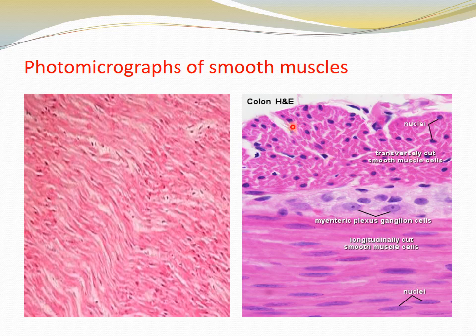So these are the transversely cut bundles or the fasciculus of the smooth muscles, and you can see there are nuclei in some areas. Depending upon the section, in some areas the nuclei are absent. Because if we cut a section transversely from here, areas which have the nucleus will appear as such here, and the areas which come without the nucleus are as such.